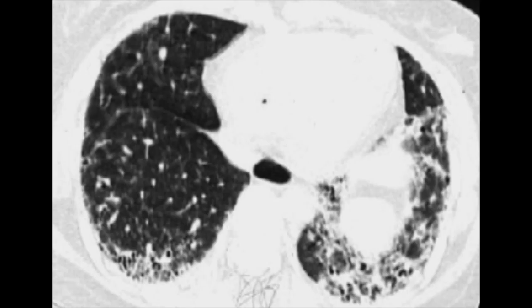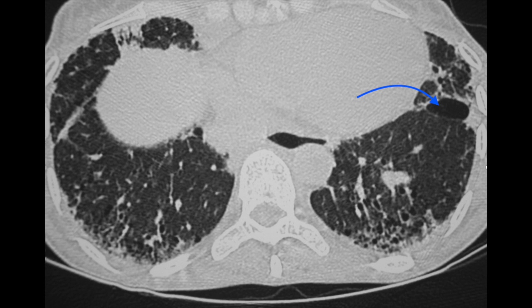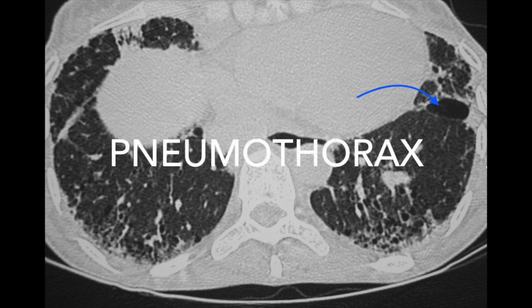As of now there is no honeycombing but also no ground glass. In the same patient, the basal segments show honeycombing. The moment you get honeycombing, this is irreversible. In cases of IPF, lymph nodes can occur. Fissures can rupture forming either small loculated pneumothorax or mediastinal honeycombing can rupture and form small pockets of pneumomediastinum.